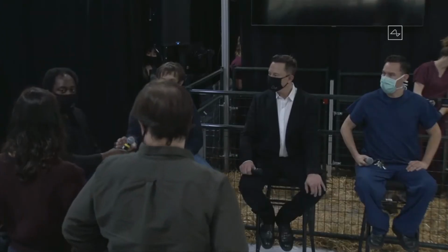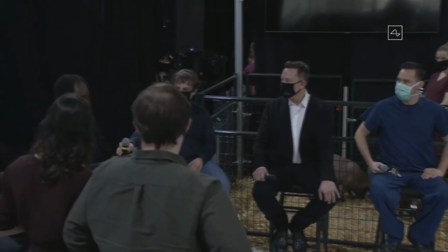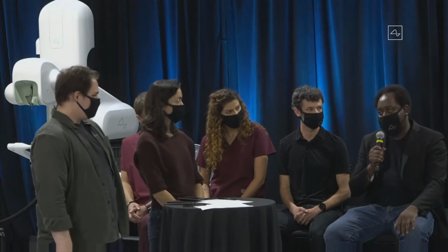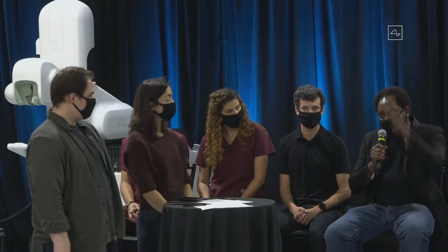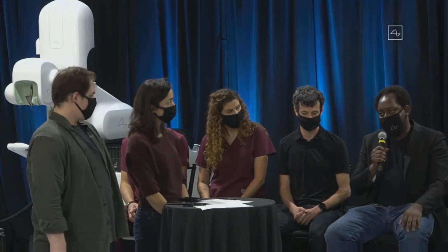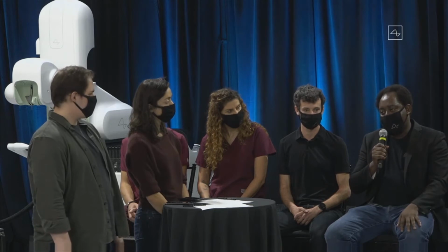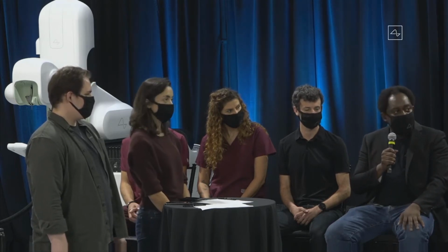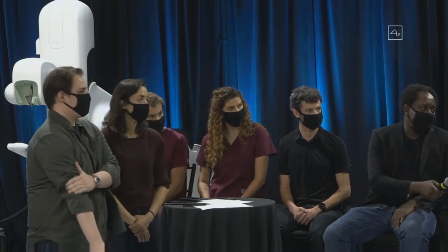And when you say thin, how thin? So one strand of your hair is about 100 microns in diameter. We can think about dividing that into 20. So one of the thicknesses that we're working on is about 5 microns, and we have the possibility to go even thinner in the nearest future. We think we can probably go sub-micron in thickness, but obviously, the thinner you make the wire, the harder it is to sense the signal and to do stimulation, because there's less cross-sectional area for the current to traverse.